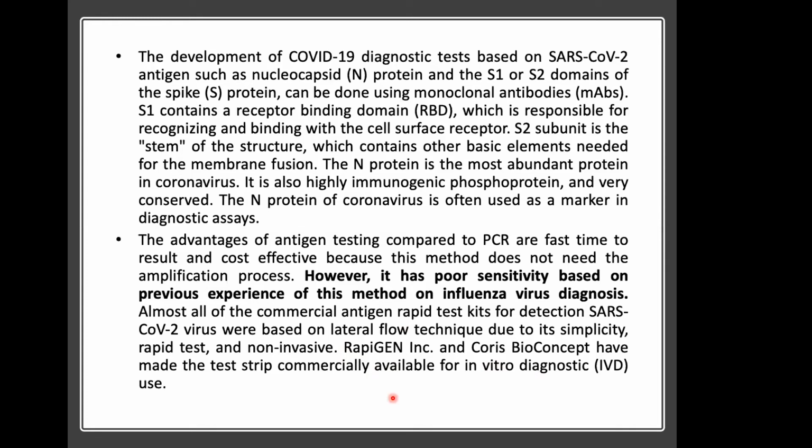And there is another possible issue with the biomarker itself. The antibody developed, be it polyclonal or monoclonal, has to be good before being used in the production of the lateral flow. If the antibody, monoclonal or polyclonal, or probably aptamer, is not good enough, then the test kit is not going to be very good. So these are a few issues in terms of how good the test kit being developed is. Definitely a clinical study with a lot of samples has to be carried out side by side with RT-PCR. Hundreds of samples should be tested, to see the compliance of these test kits with the standard method of RT-PCR.